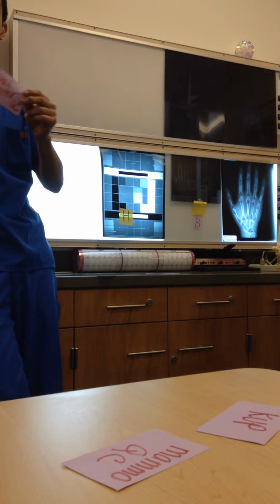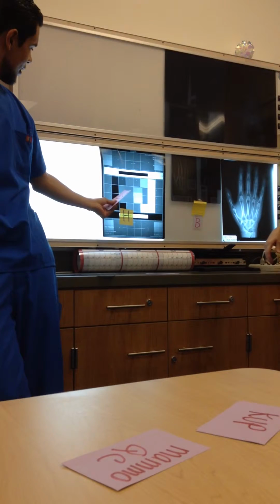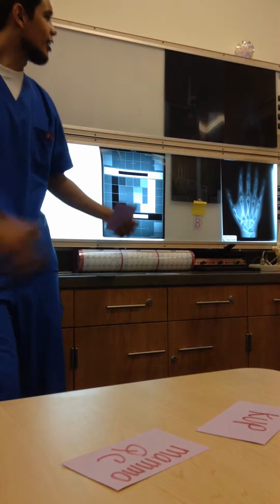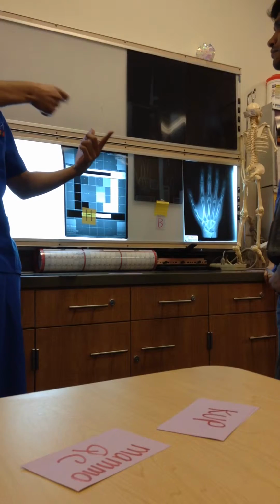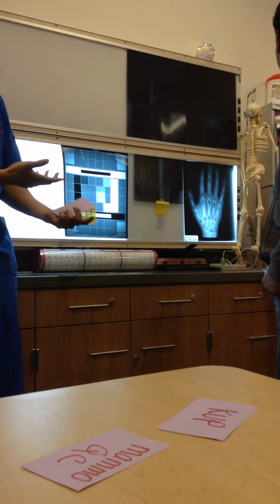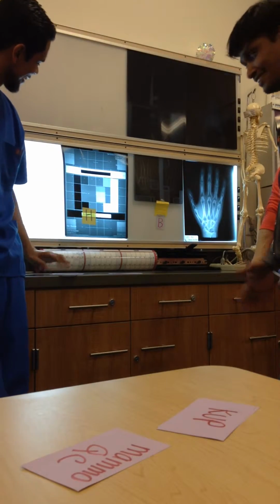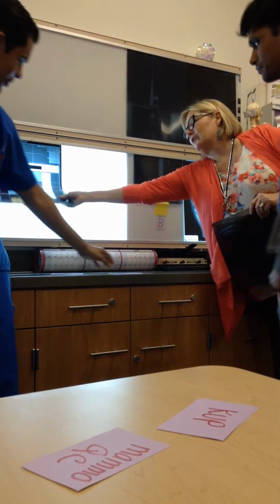CRT. That's what it is. So what measures the CRT? What's that handheld thing, right? No, that's the handheld fluoro. A digital monitor, a computer screen. No, that was the photometer to measure the light. This measures the CRT resolution, or digital monitor. So you picked the right film, you just didn't have the right cord.